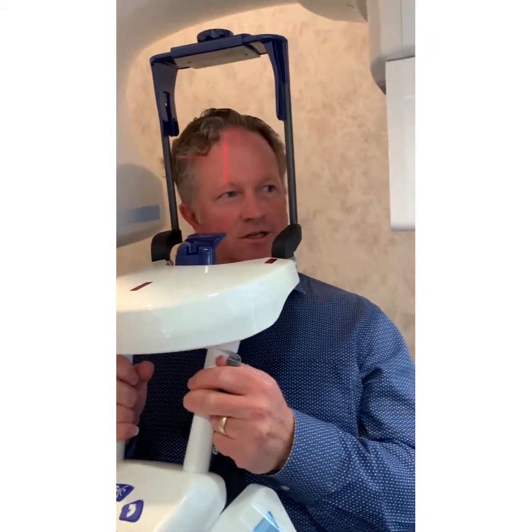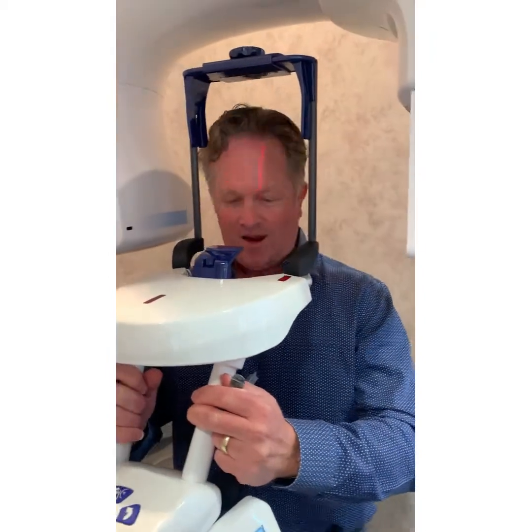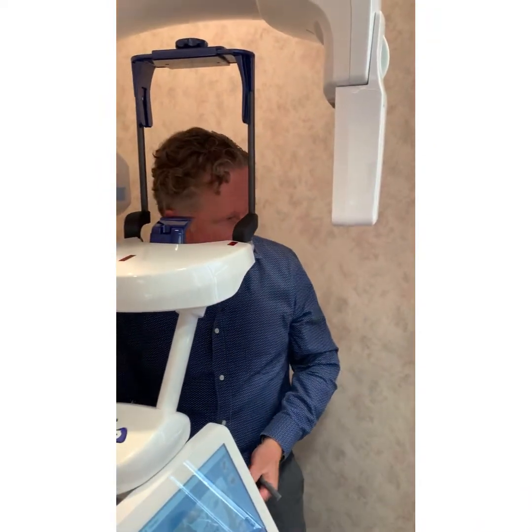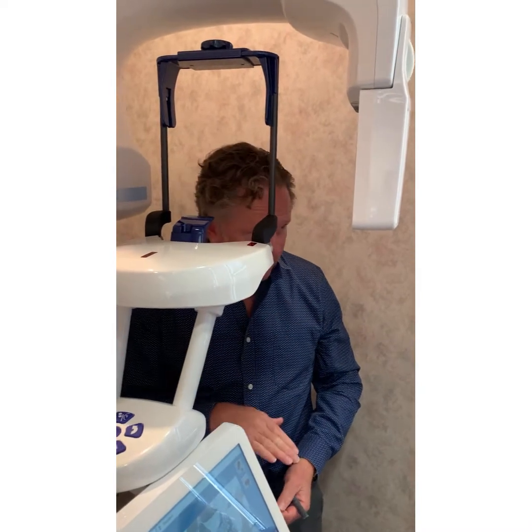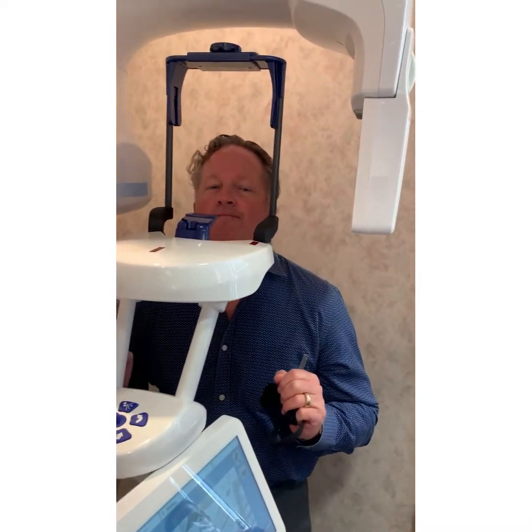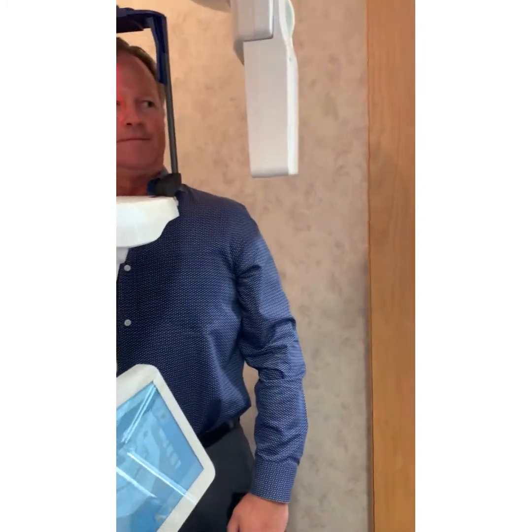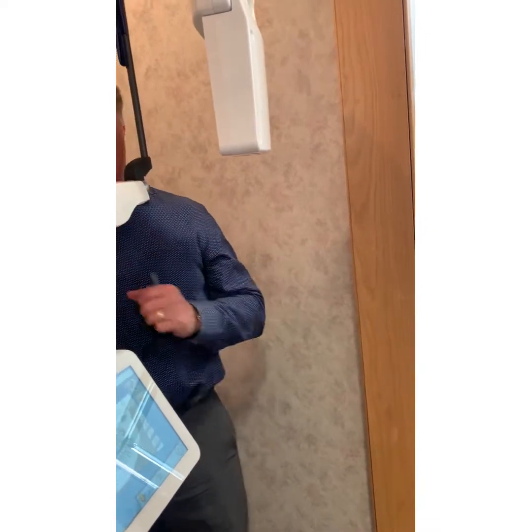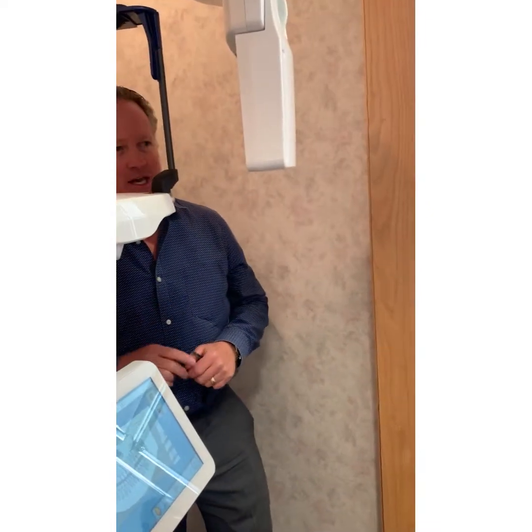This is the key here. We don't put people in water ski position anymore. That's how I learned actually. We just want weight on the heels because we still want the back going like this and the neck going like this. Anybody ever see that 10-lane white highway that washes out all your interiors? It goes right through the middle. They're trying to adjust for that. You're gonna hang everybody, I hate to use that terminology, but you are. You just gotta stretch everybody out, and that minimizes that shadow that goes through the center.